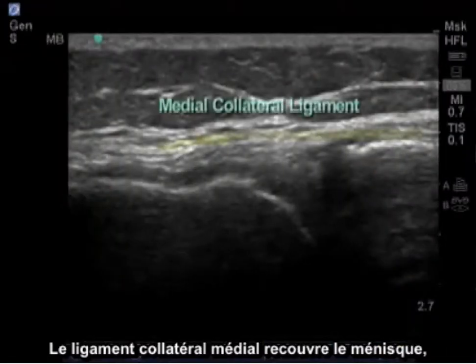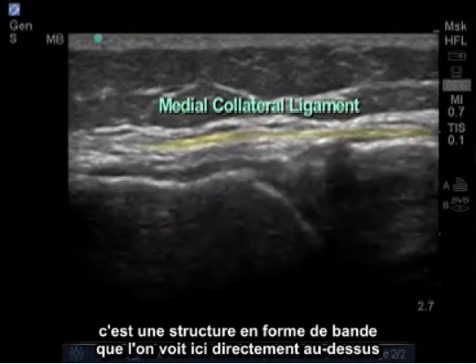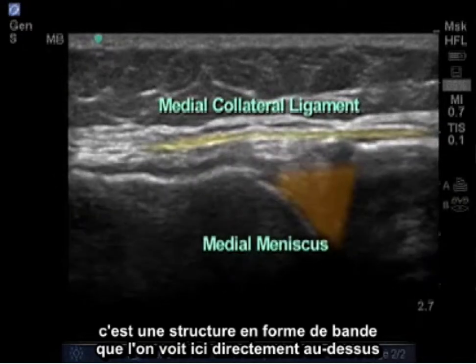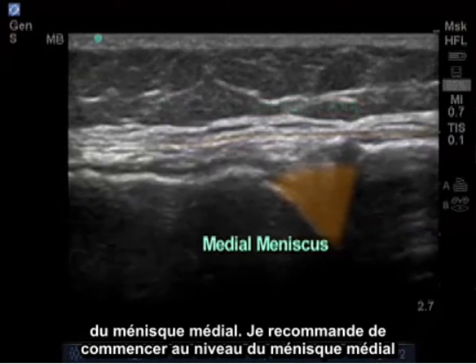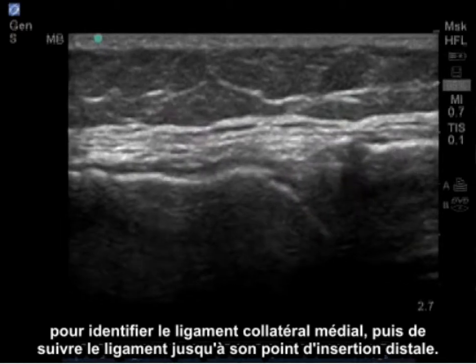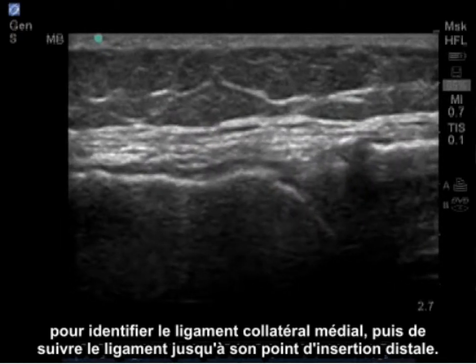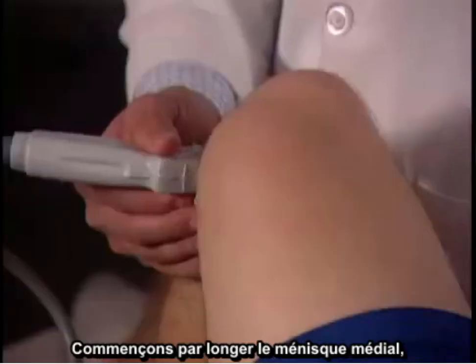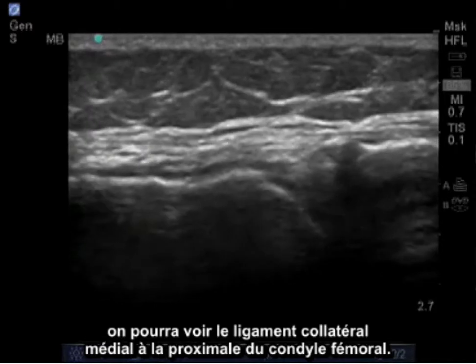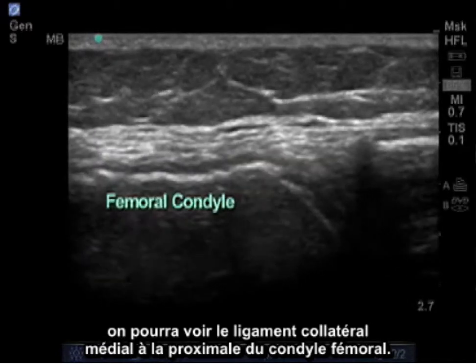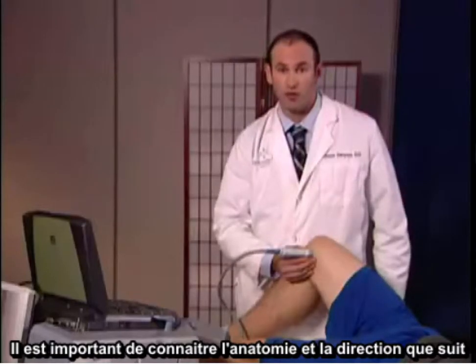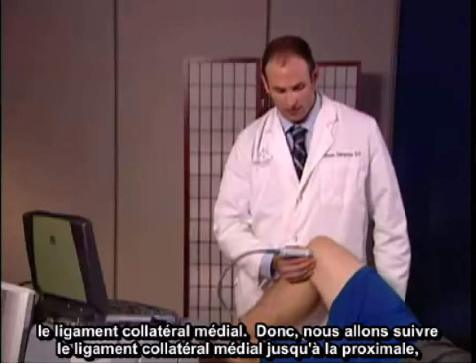Overlying the meniscus lies the medial collateral ligament, which is a band-like structure that we can see directly above the medial meniscus. I recommend starting at the medial meniscus to identify the medial collateral ligament and then tracing the ligament at its proximal and then distal insertion. It's important to have knowledge of the anatomy and know the direction that the medial collateral ligament travels.